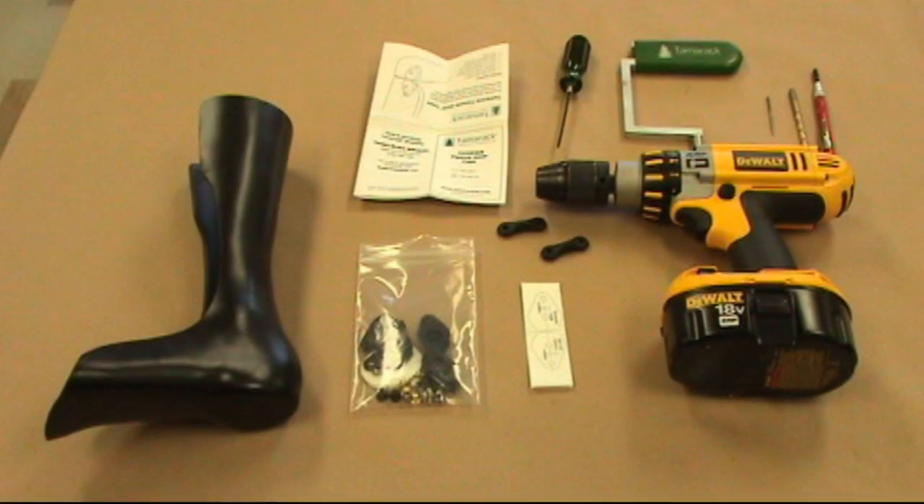Each Tamarack Flexure Joint Caps package includes two upper and two lower cap assemblies, plus attachment hardware and shearband patches.